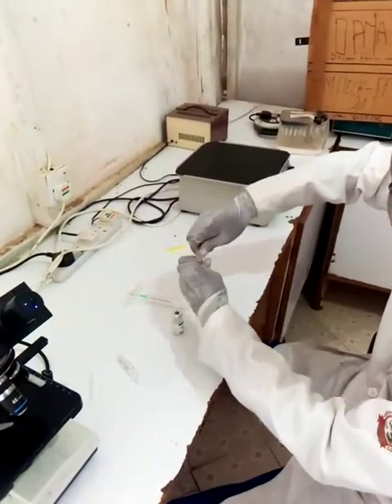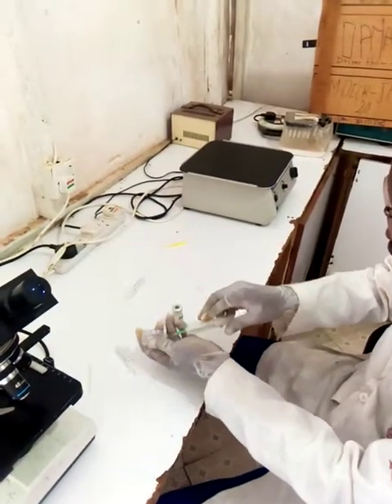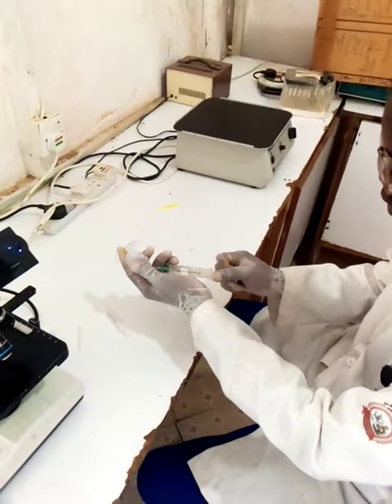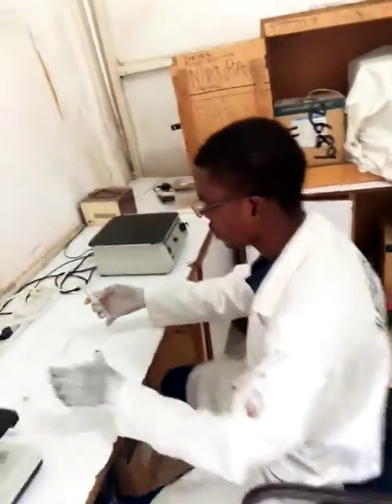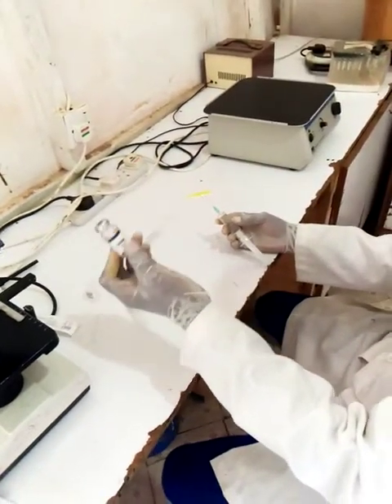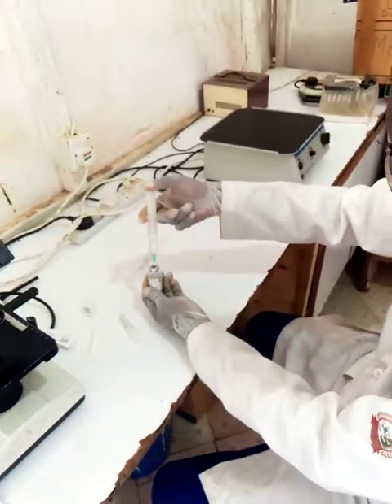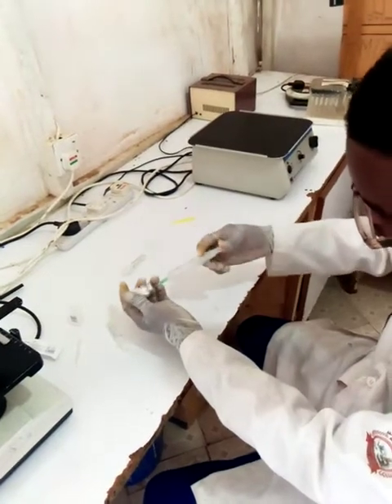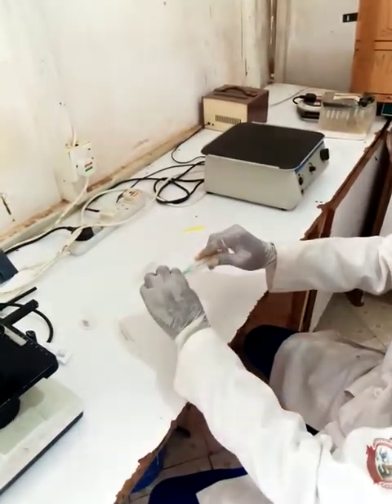Then I am going to open it, then remove it, then take some water. I am mixing the 10ml of water for injection into the vial of Ceftriaxone, which is 1000mg. Then I mix it well.